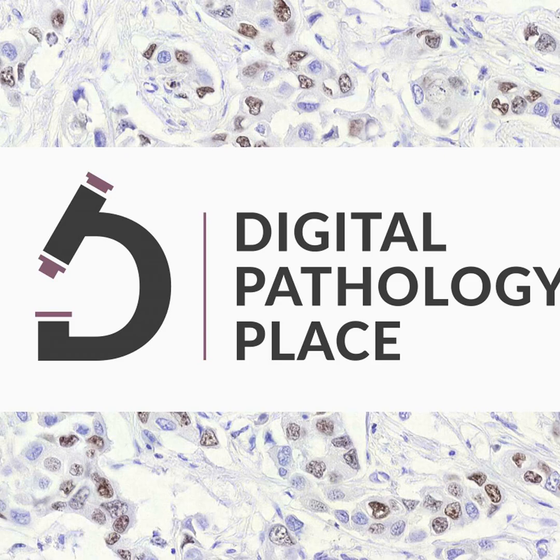Furthermore, these FDA-approved or cleared algorithms are often paired with what is known as a companion diagnostic laboratory test. A companion diagnostic is a medical device that provides information essential for the safe and effective use of a corresponding therapeutic product. For instance, in the case of cancer patients undergoing targeted therapy, the expression level of a specific protein in tissue might determine the efficacy of a certain drug. A companion diagnostic test is then used to ascertain the presence and quantify the levels of this protein in patients.